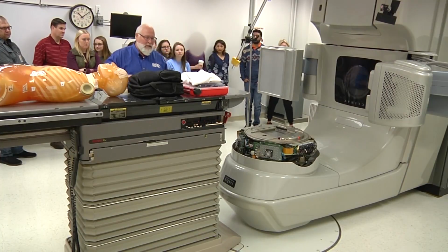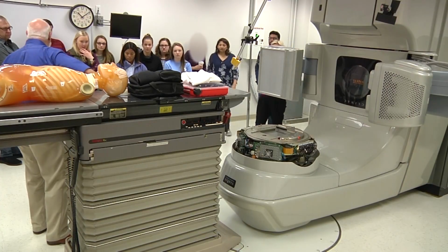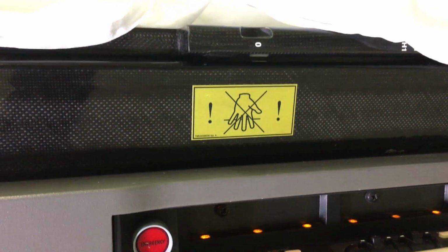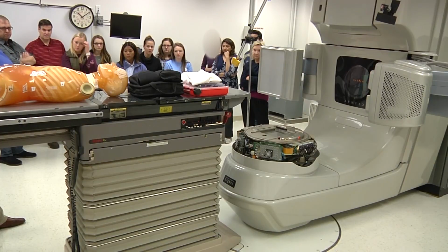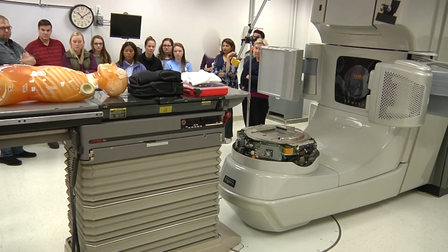So we mentioned the couch and pinch hazards. You'll have a lot of warning stickers here. You don't want to grab it from underneath. This one has a plastic underneath. That was one of Varian's modifications to keep you from grabbing it underneath and sliding it back and forth.